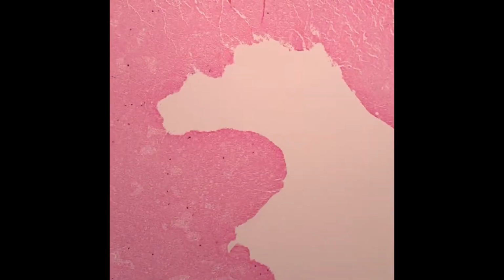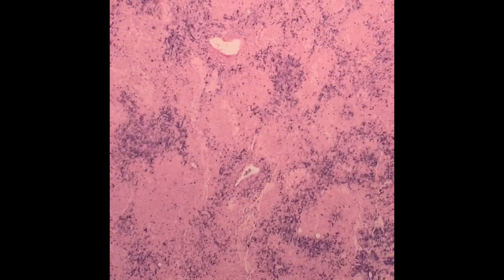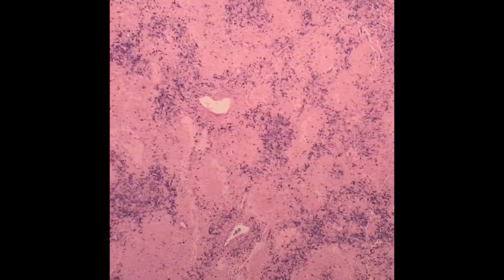So this is in situ hybridization for lambda. We see a few positive cells. And then here's the stain for kappa RNA. So clearly we have a restricted population of kappa, which was the same light chain as the outside flow cytometry had reported. So we're fairly certain now that the small B cells, monotonous population, and the plasma cells are related.